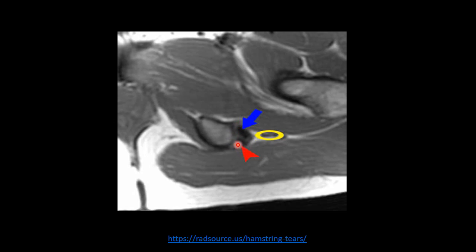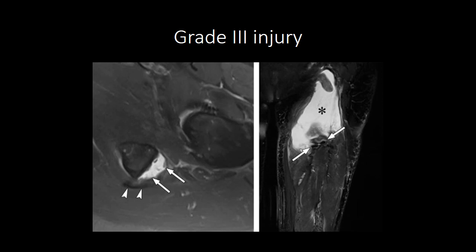The ischial tuberosity gives origin to the hamstring group of muscles. Posteriorly, this is the common origin of biceps femoris and semitendinosus. Anteriorly, this is the origin of semimembranosis. Lateral to these is the sciatic nerve, labeled with a yellow circle. Injury to the sciatic nerve is common in avulsion injuries at the ischial tuberosity. In this case, the common origin of the hamstring group of muscles is not visualized at the ischial tuberosity and there is mild fluid. The coronal images show torn and retracted proximal myotendinous junctions with a large hematoma filling the gap between the torn ends. This is a grade 3 avulsion injury.